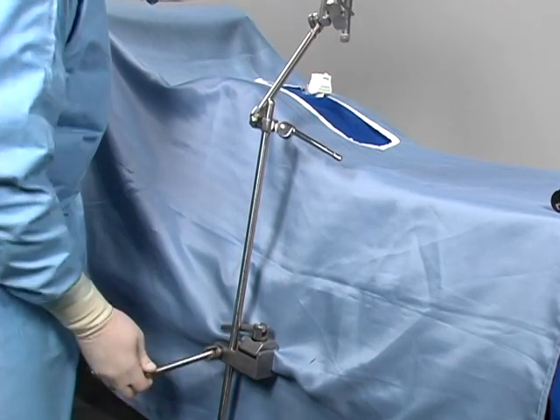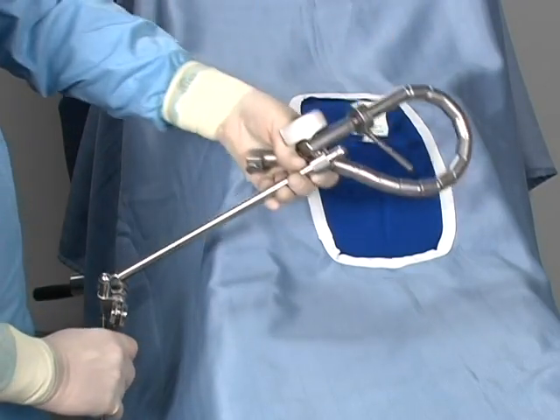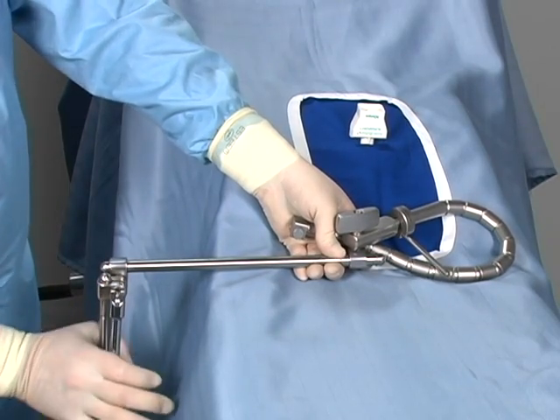Position the extension arm in a low-profile position, making sure the FlexBar arm reaches the trocar site. Once the extension arm is positioned properly, lock it in place.